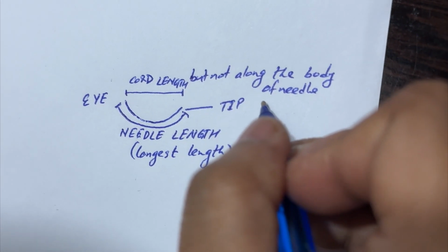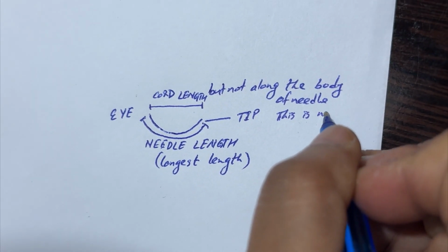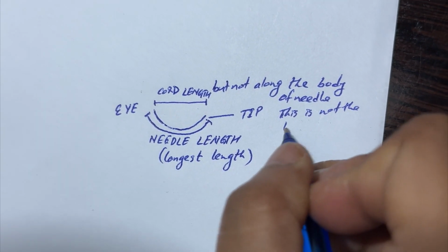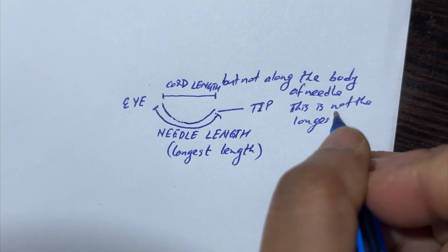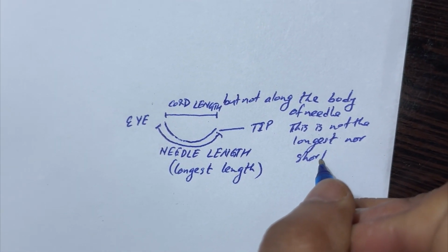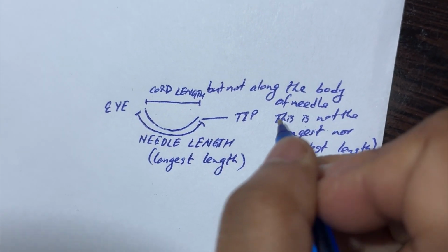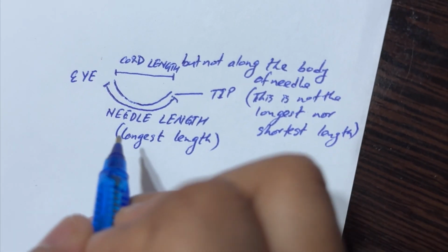And this is neither the longest nor the shortest length, okay? This was understood?